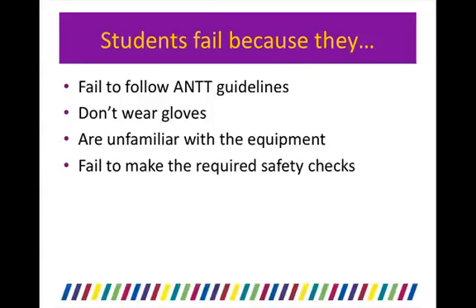Students would fail this station because they fail to follow ANTT guidelines, because they don't wear gloves during the station, because they're unfamiliar with the equipment or the procedure, because they fail to make the required safety checks when giving IV medication.